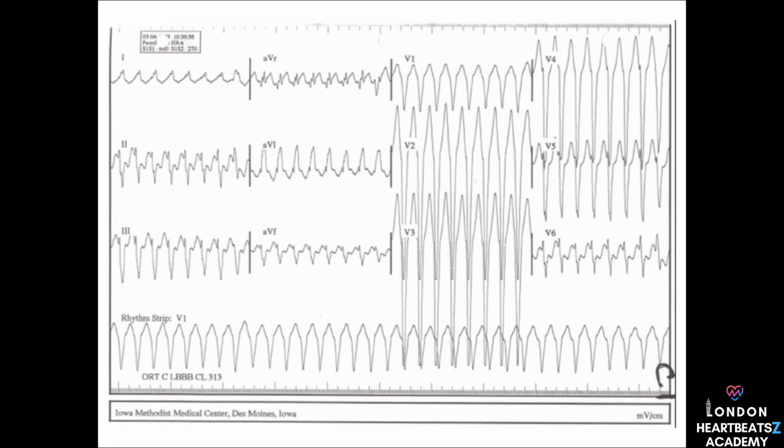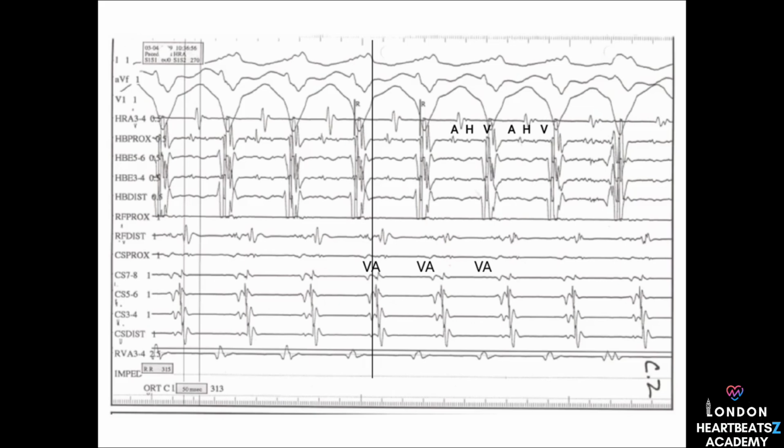Okay, so this time the roadblock's on the left side. What about the intracardiac electrograms in figure C2? We're seeing normal His to ventricle intervals, meaning the signal's going down the AV node, the usual route. But the VA interval, the time for the signal to go from the ventricles back to the atria, that's longer than 60 milliseconds. Tells us it's not likely to be AVNRT. Interesting. So normal conduction down, but a slow trip back.